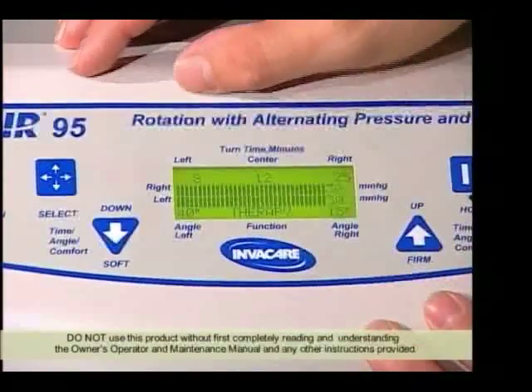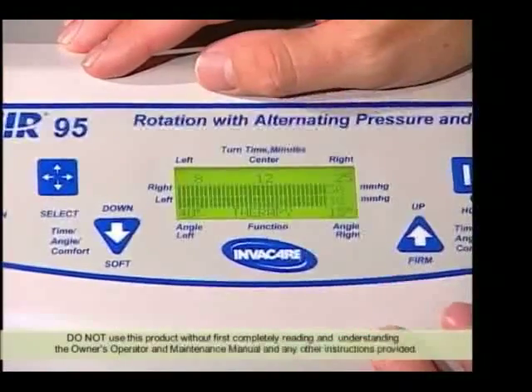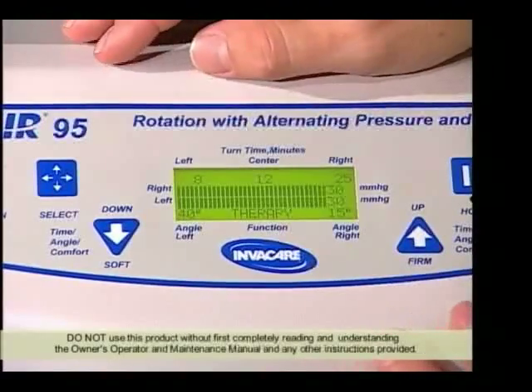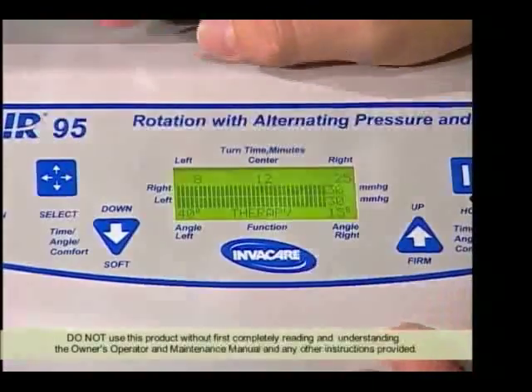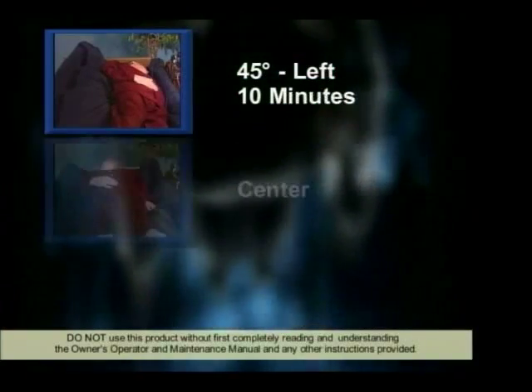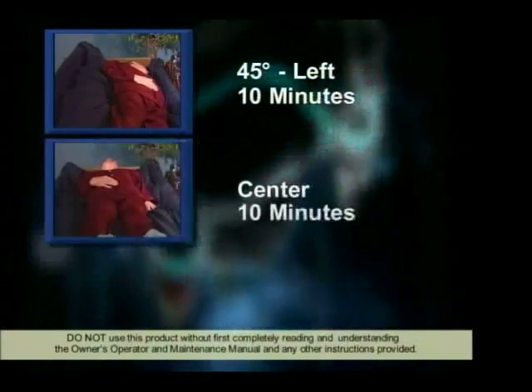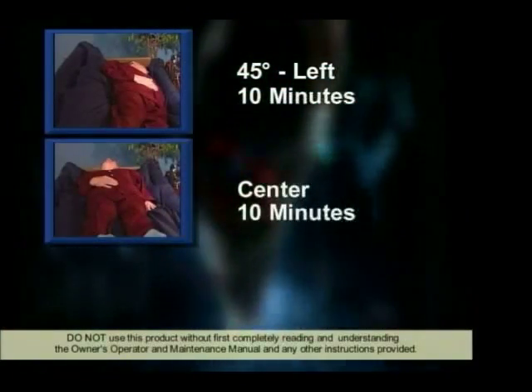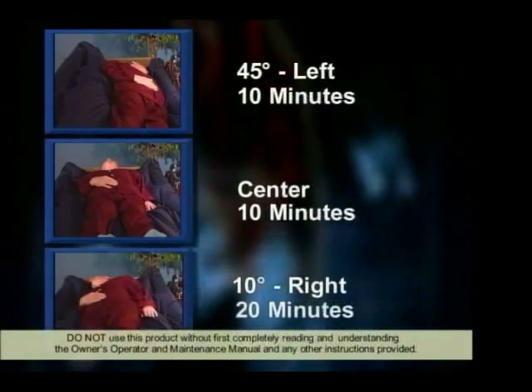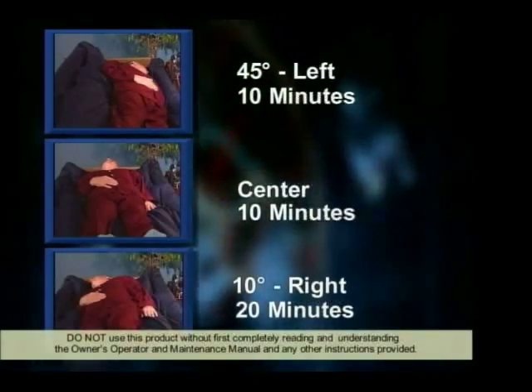Let's set this up for a patient. Let's say the doctor's order or prescription indicates the patient needs to turn 45 degrees to their left for 10 minutes, dwell in the center for 10 minutes, and turn 10 degrees to their right for 20 minutes.